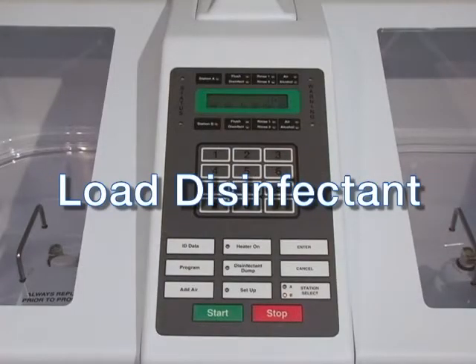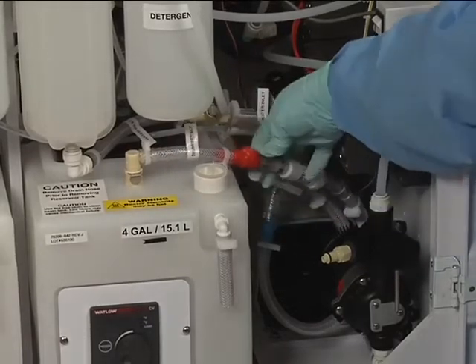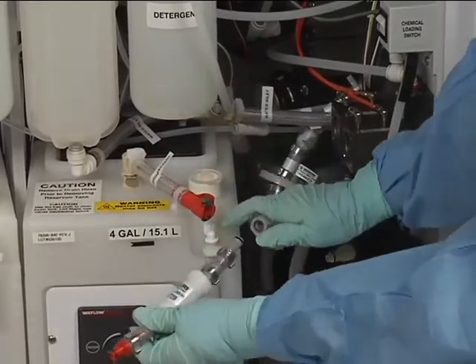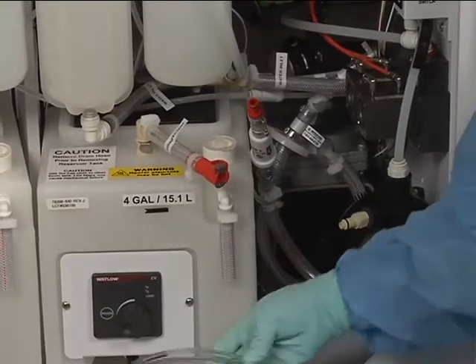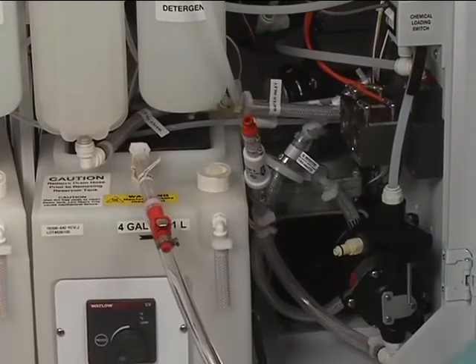You are now ready to load the disinfectant, either automatically using the onboard transfer pump or manually with the load disinfectant function. The automatic transfer pump minimizes operator exposure to vapors by loading the disinfectant directly from the disinfectant container into the reservoir. To perform this, locate the reservoir-to-disinfectant-filter connection and disconnect them at the red connection. Fully remove and replace the old disinfectant filter. Locate the transfer pump tubing segment with the red male end and cream-colored female end, and connect the red male end to the red female end of the reservoir assembly. On earlier DSD models, the female end of the reservoir tubing may be cream-colored.